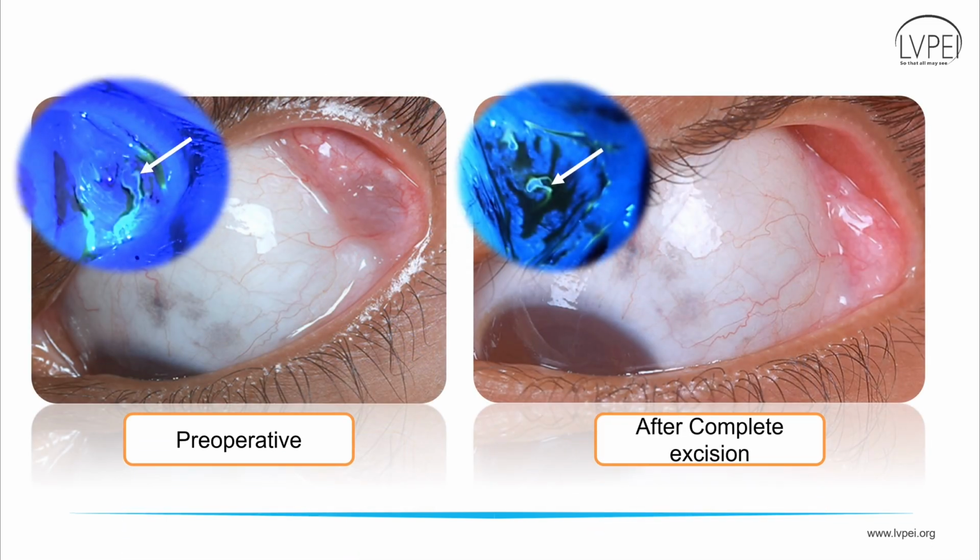Here is a pre- and post-operative image of another patient, a young female who underwent surgery for unilateral Dacryops. The preoperative image of DATS in the inset on the left shows an arrow pointing at the patent lacrimal duct opening, which served as a guidance during surgical excision. A patent ductule is seen in the postoperative DATS image in the inset on the right as well.